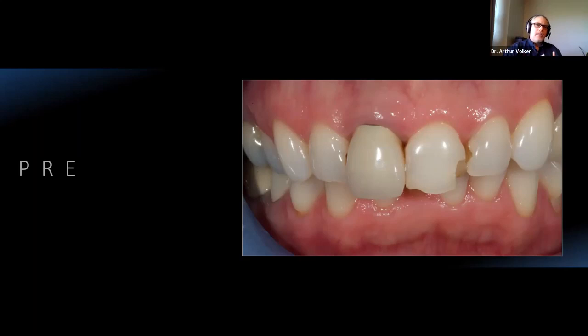Just so that you know, the least abrasive material to adjacent teeth currently is glazed zirconia. So if it brings some controversy, I don't want to get too much into it, but just know that glazed zirconia is the kindest to the antagonistic tooth. But just know also that sometimes over time the glaze will wear. So some people are advocating, if you have anything to polish your zirconia surfaces, and there's some very, very nice kits from Comet, kits from Brasseler to polish your zirconia restorations, because the glaze will wear over time and can become a little bit abrasive. But still nothing like what we see with these worn older PFM restorations.